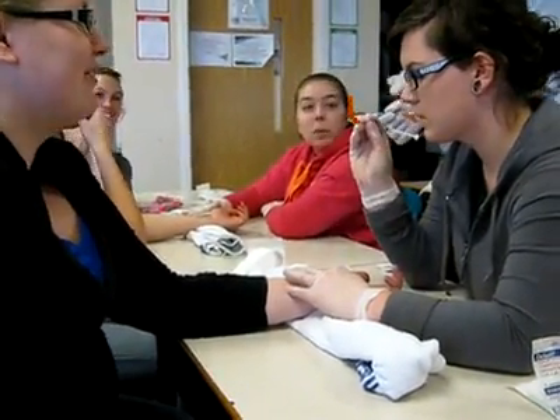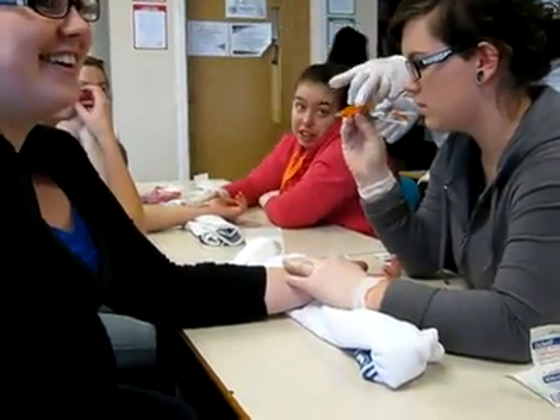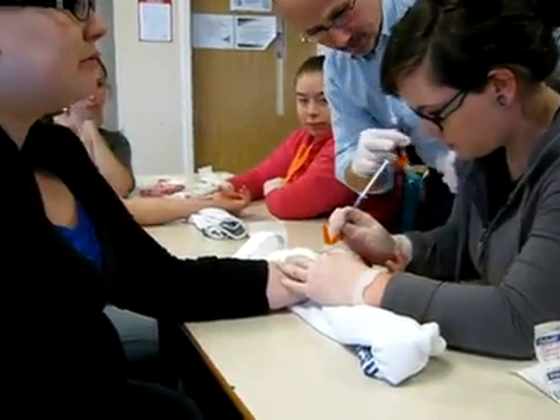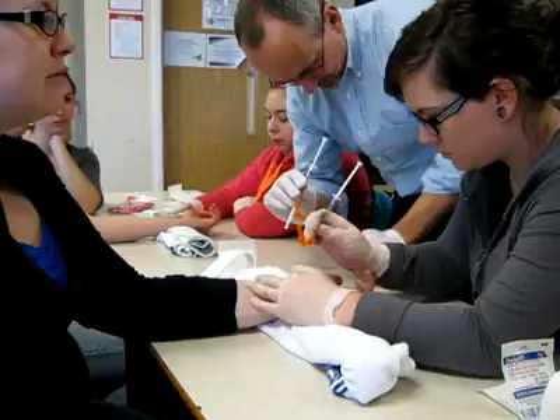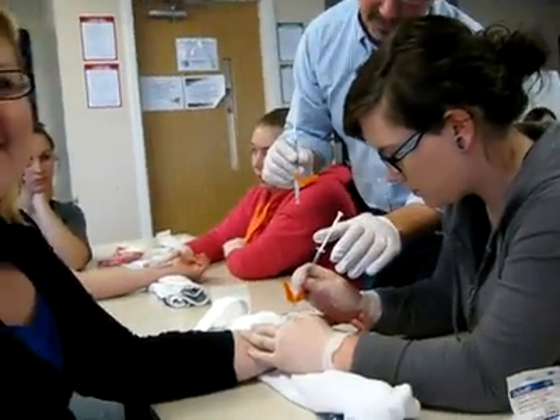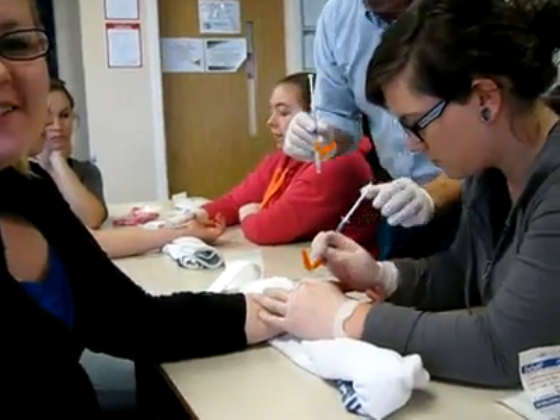I can't feel it. You can just roll this guy back in. 45 degrees to her wrist. I'm going to get you to move your bum over that way a little bit. Do you need more pressure? Yeah, that's excellent. I'm in. So 45 degrees and bring this hand over here. You got it, Tess.